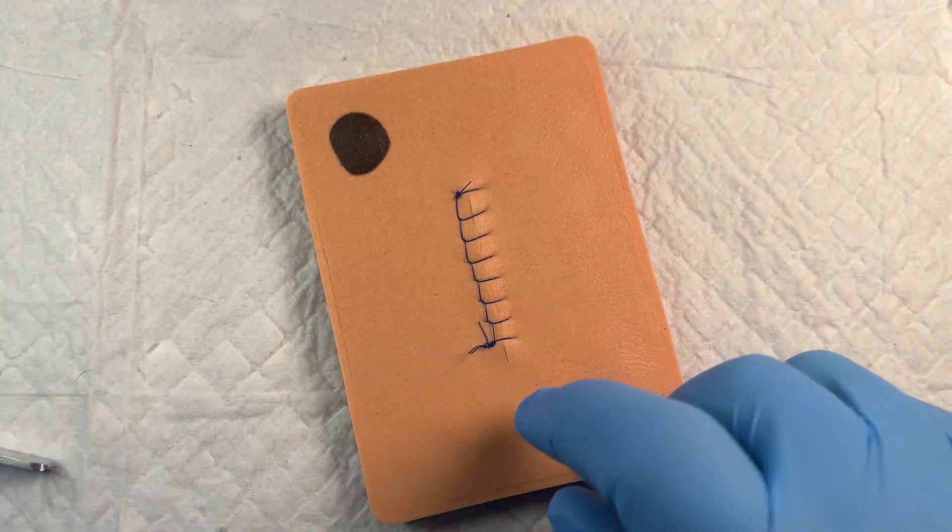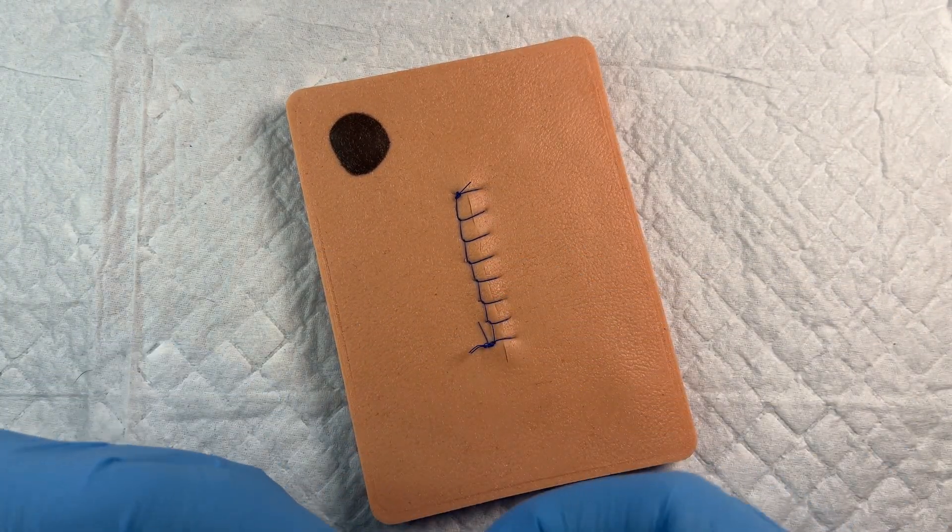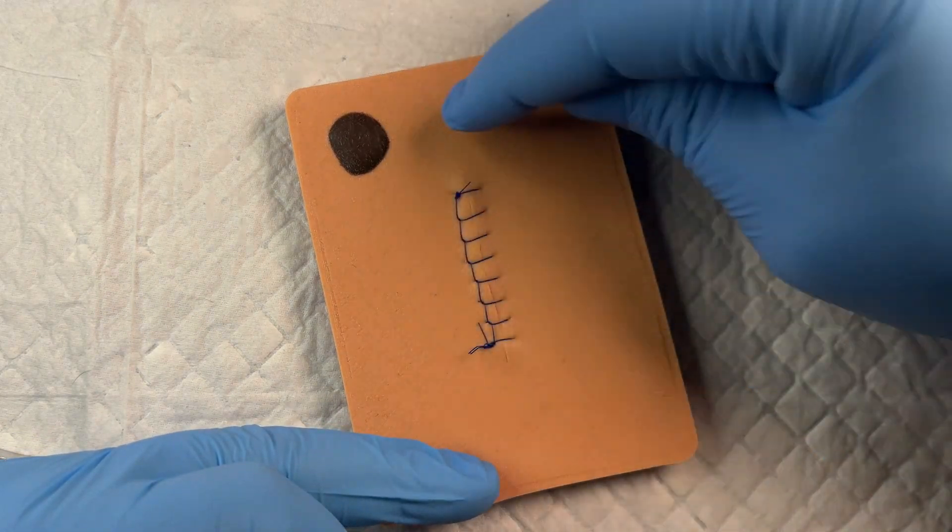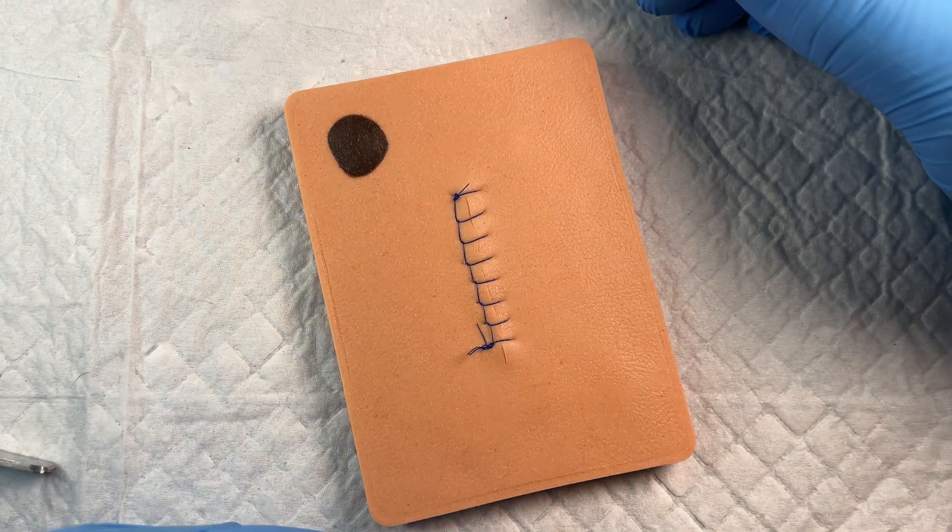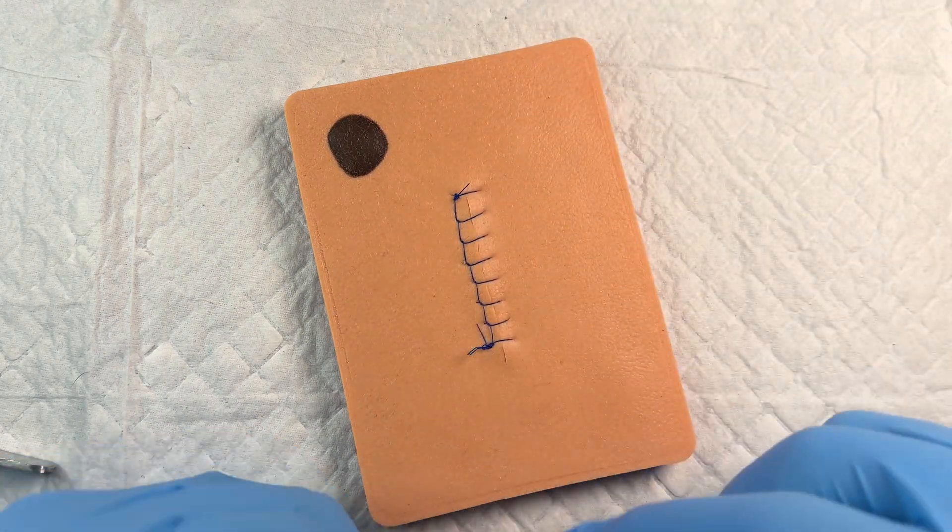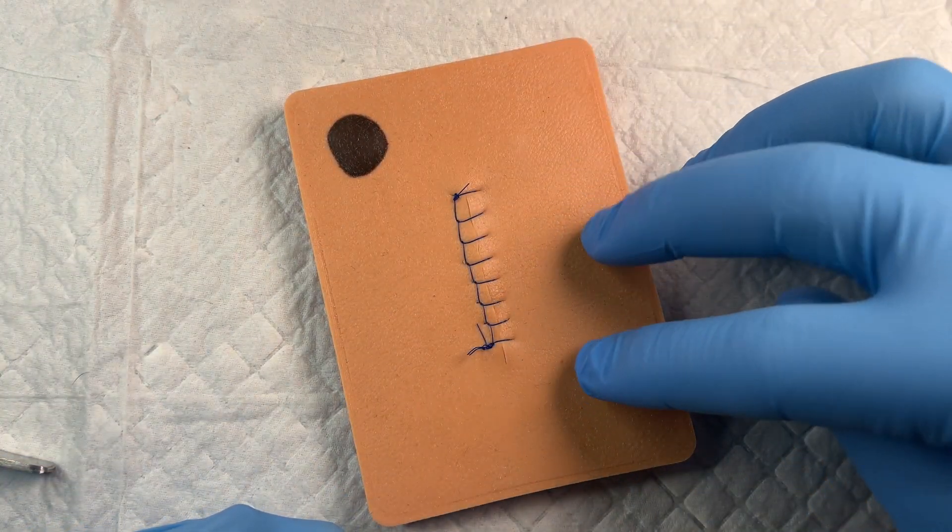Now, one thing that's important when you are removing sutures, remember that this wound and the sutures themselves have been exposed for 7, 10 days, however long these sutures have been in, to the skin around it, which has normal bacteria.